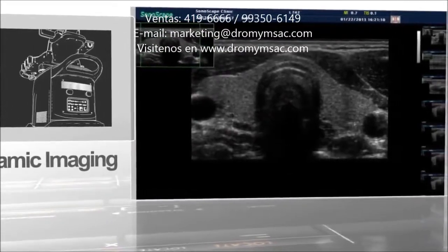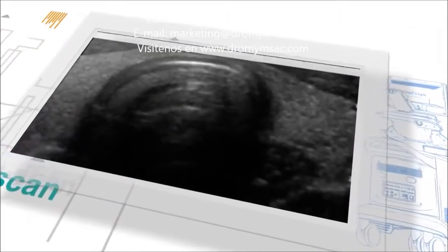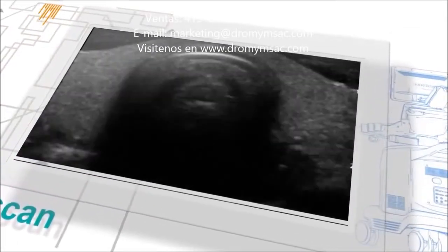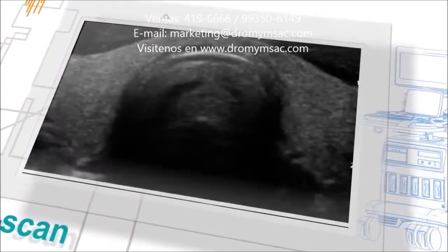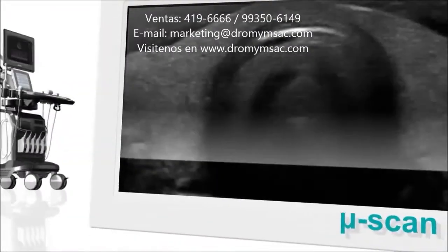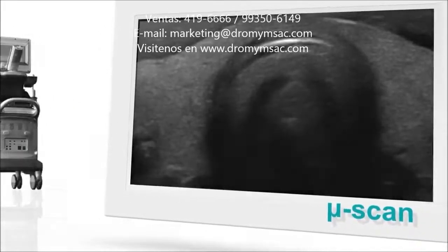Panoramic imaging allows an extended field of view to scan large organs, increasing the possibilities of making reliable and quick diagnoses. μ-scan imaging technology can clearly visualize tissue boundaries, reduce speckle noise, and increase both spatial and contrast resolution.